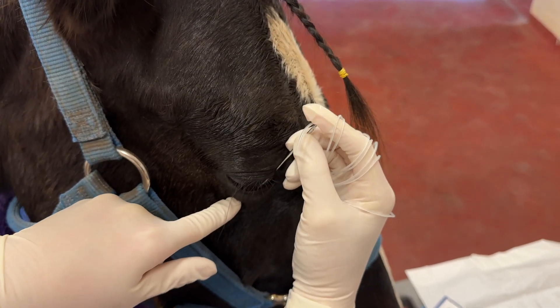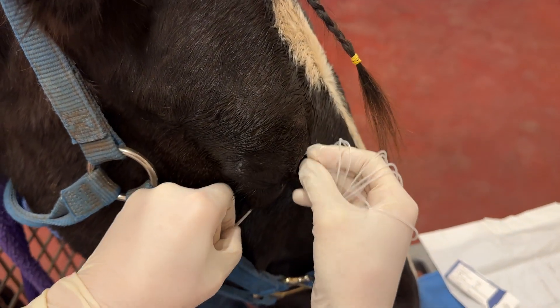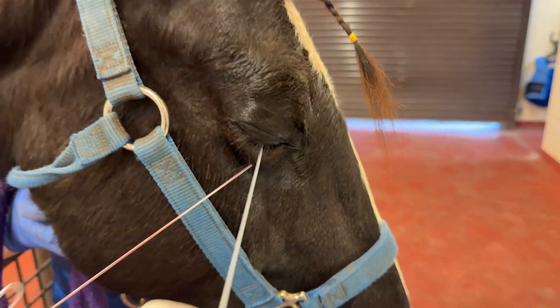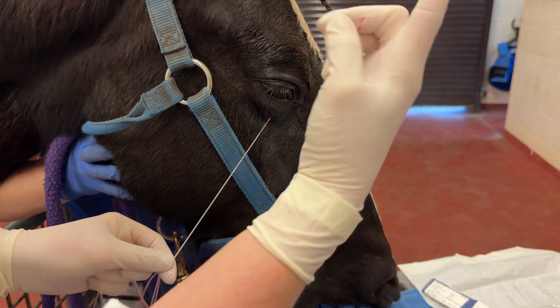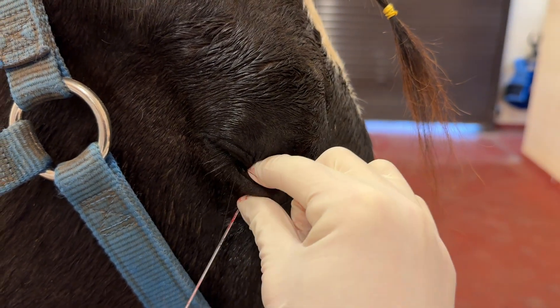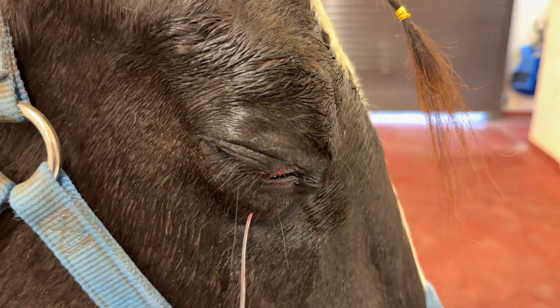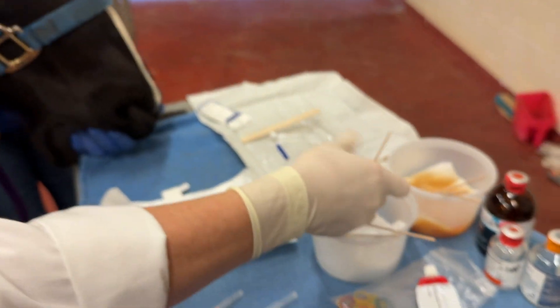Once you've felt the bone, you can just barely walk off that bone with the trocar and drive it through the eyelid. You have to place the needle at a slight angle in order to drive it through the eyelid easily. Then you're going to pull the lavage line down with a snug tug and use your finger to palpate that foot plate right against the bone. If it's not against the bone and it's too far on the palpebral conjunctiva of the eyelid, you're at risk of that foot plate actually causing corneal ulcers.